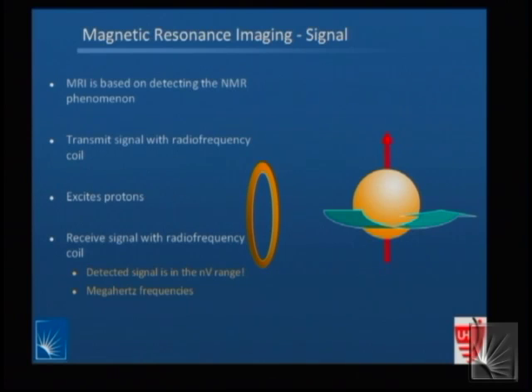So right away you should be thinking, gosh, I'm going to need some way to create a radio frequency pulse that's going to go out into the body, so I'm going to need amplifiers and some type of coil or antenna to create the magnetic field. As the body re-emits it, I'm going to need detectors to pick up that signal. I'm probably going to need to digitize it and that kind of stuff. And we're going to talk about all these different things. One of the interesting things is to create that transmission, to create that radio frequency field to start with, I need on the order of kilowatts of energy.